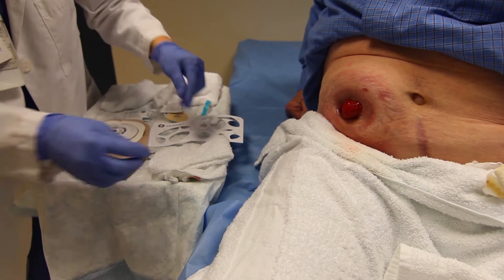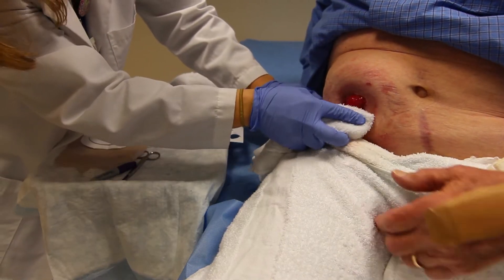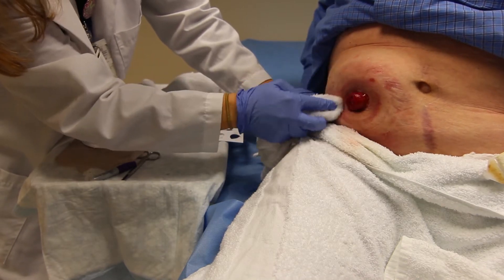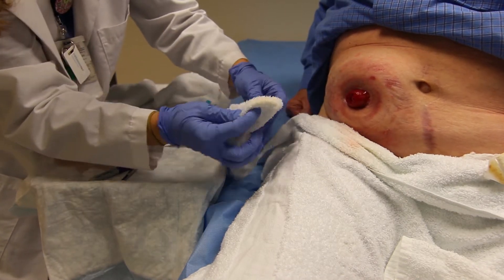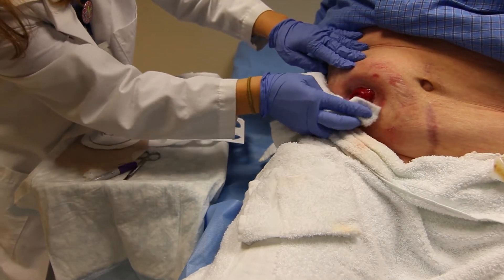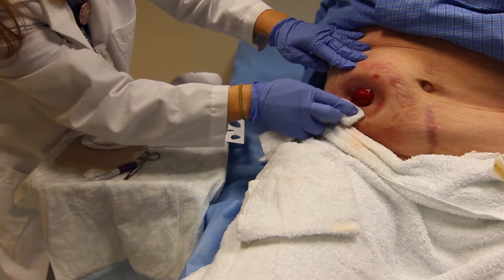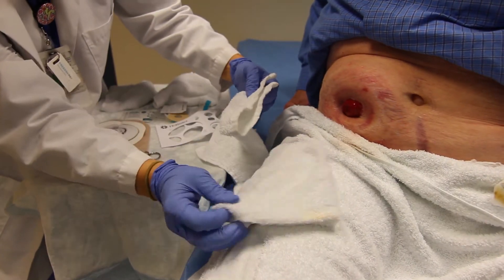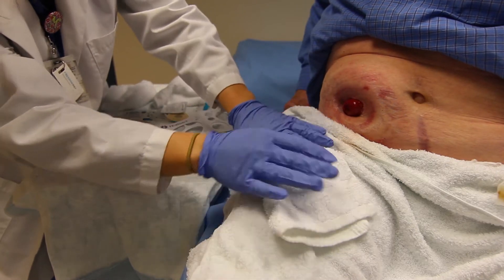Next, clean the skin with a soft cloth and water. Do not use soap and water, since a lot of soaps have moisturizers as an ingredient — it may prevent the ostomy pouch from adequately sealing. Concentrate on the skin; you do not need to clean the stoma itself. If there is a lot of mucus there, feel free to remove that mucus gently without scrubbing the stoma tissue.